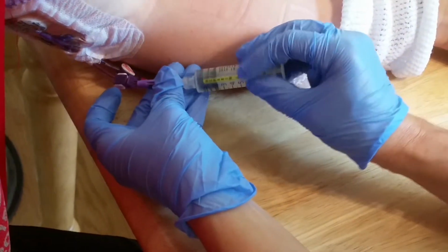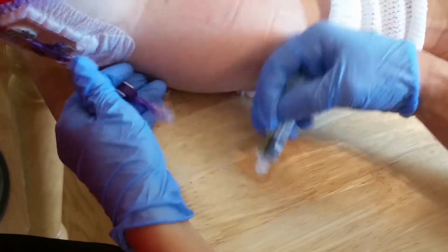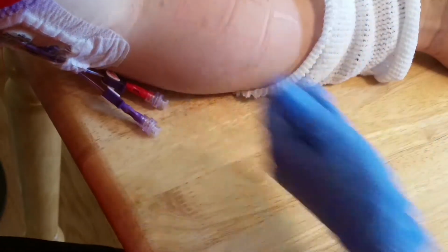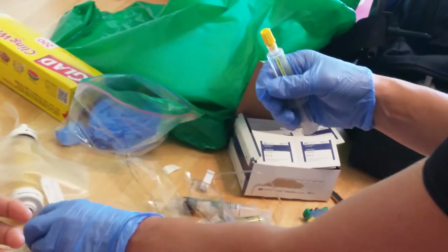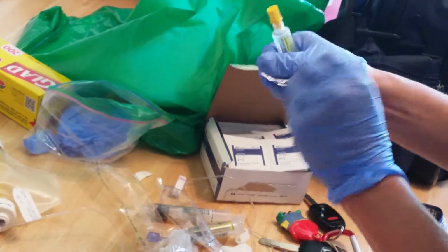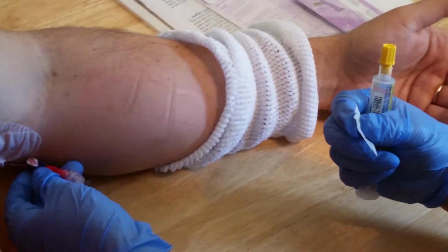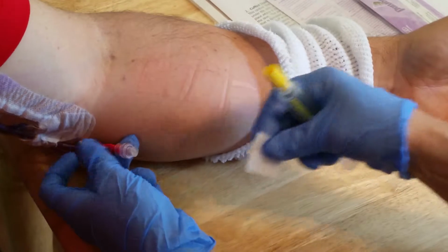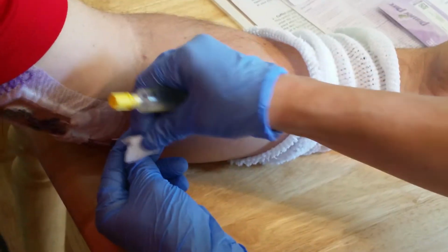You do two of them? Twist it off. And then the most important thing when you're done is make sure that that guy's clipped. Okay. I'm going to flush the other one with heparin only, just to flush it through and make sure it stays nice and clean in there. So you do two, so I should do two heparins then, basically, one in each. Oh, you're doing the other one. I'm going to flush this one since I don't really know when the last time it was flushed. So you're doing both then. Yep.